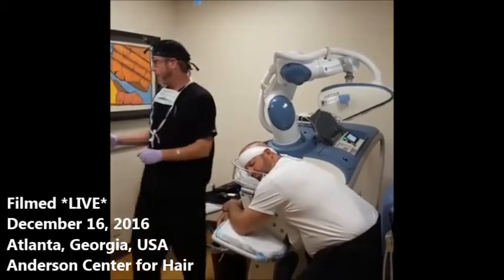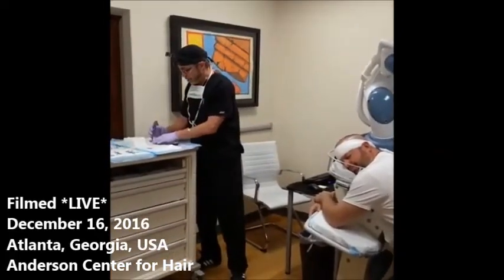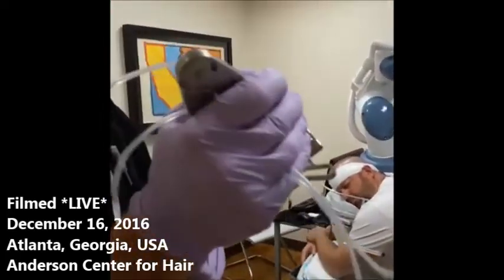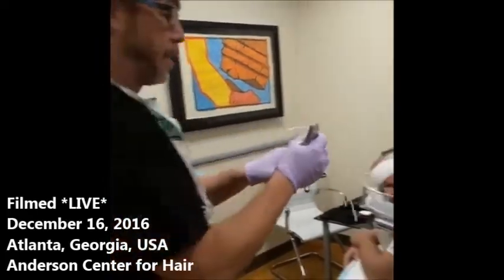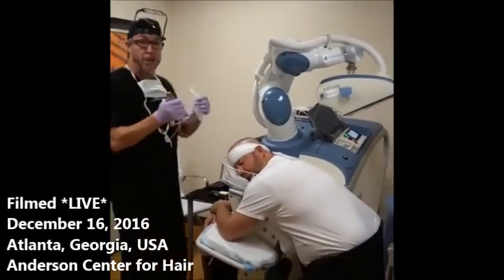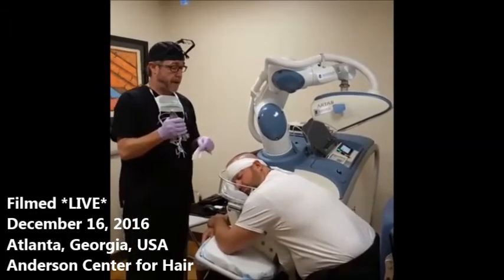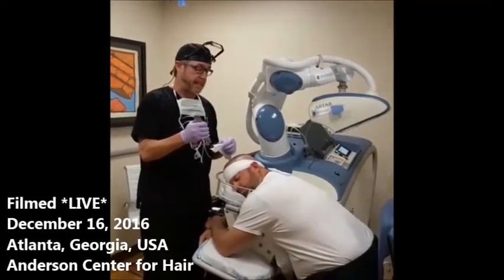The first thing we're going to be doing is taking the tensioner and applying it to his scalp. It's essentially a grid with special markings on it and tiny tines on the bottom to make sure that it grips the skin well. The purpose of the tensioner is to place tension on the skin so that when the punch from the robot comes through and extracts the follicle, the skin doesn't buckle and the follicles don't get transected.